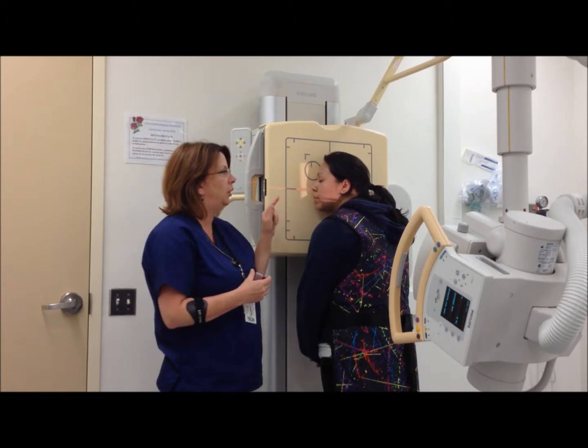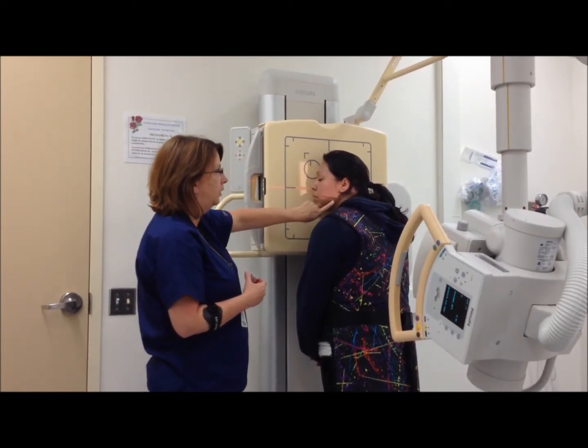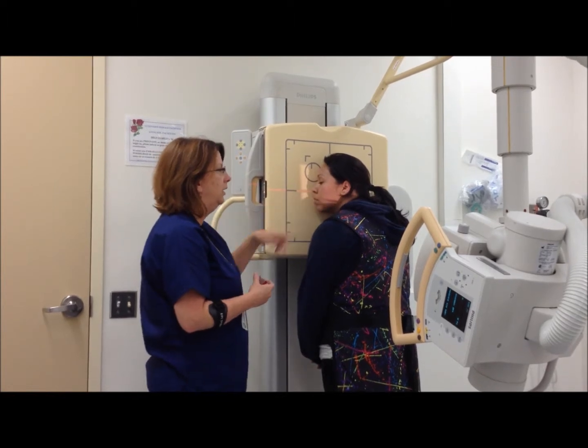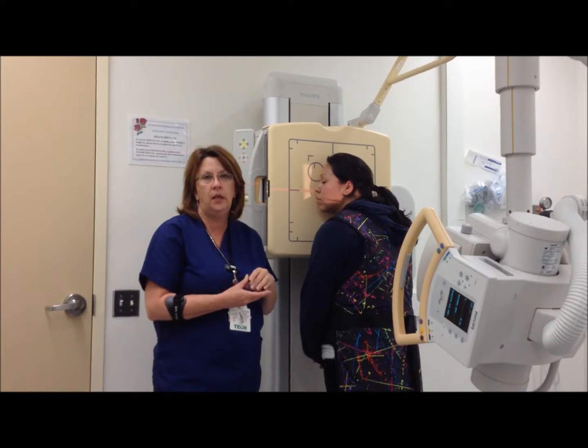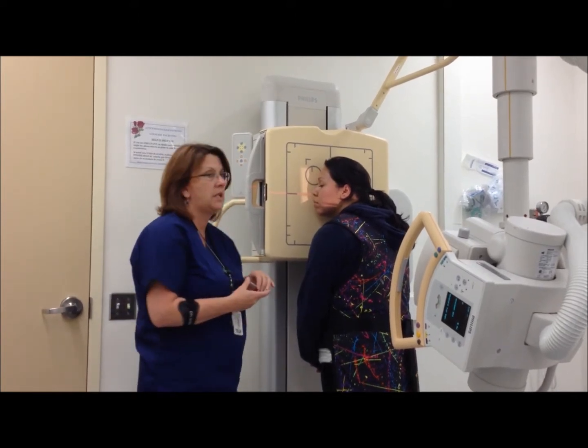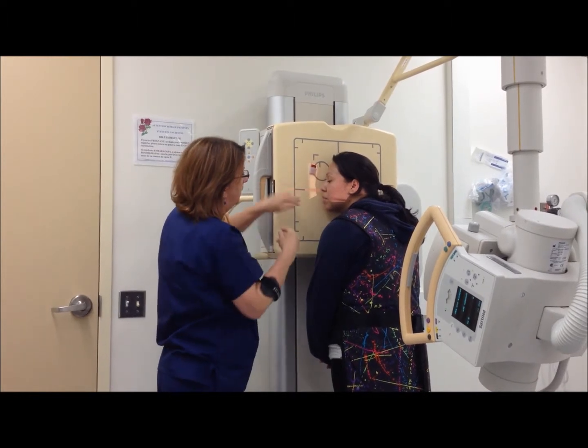This will show the mandibular body. My CR will enter at the mandibular angle, the gonion. My technique will be 70 to 75 kVp at 5 to 7 mAs. My marker will go in the light outside the patient's shadow.